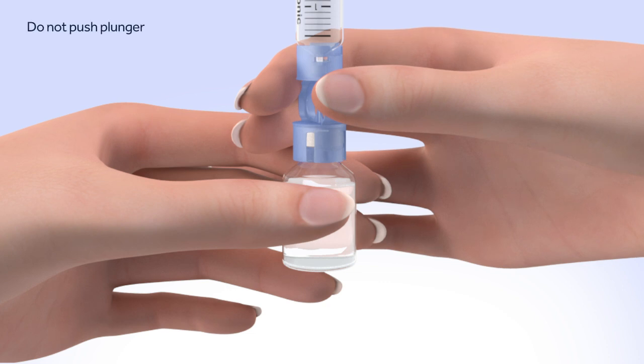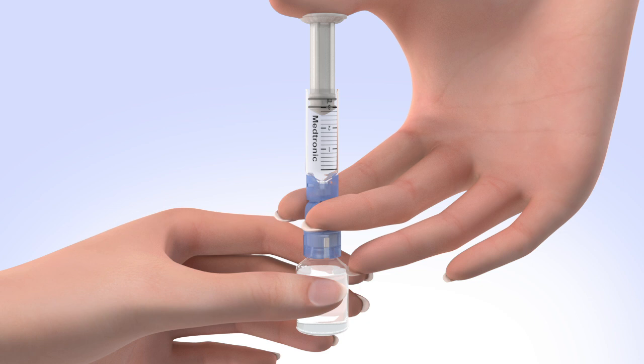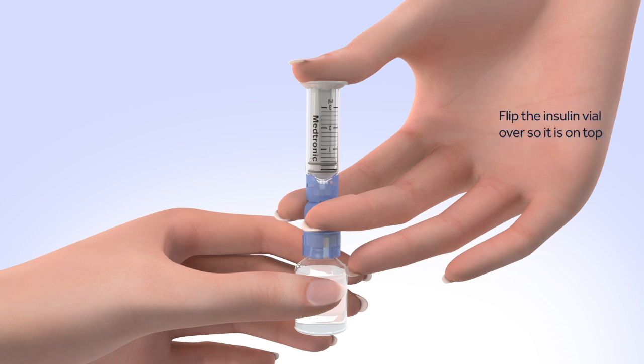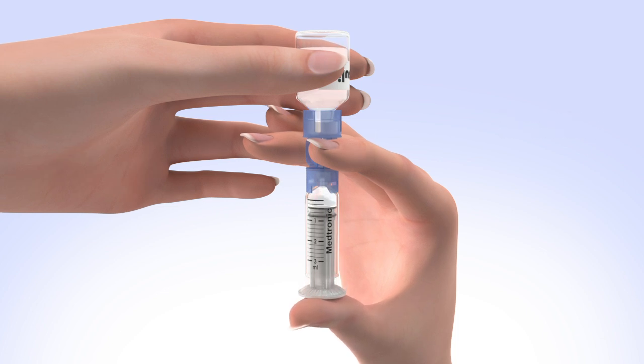Do not push down on the plunger during this step. Keep the insulin vial upright, place your thumb on the plunger, and firmly push the air from the reservoir into the insulin vial. Holding the plunger with your thumb, flip the insulin vial over so it is on top. Make sure you are holding the vial with your other hand. Slowly release your thumb pressure from the plunger rod, and the reservoir will start filling with insulin.